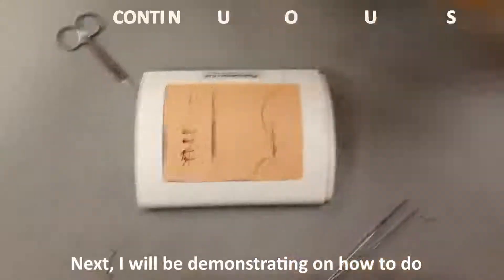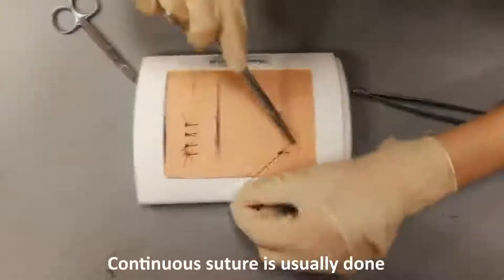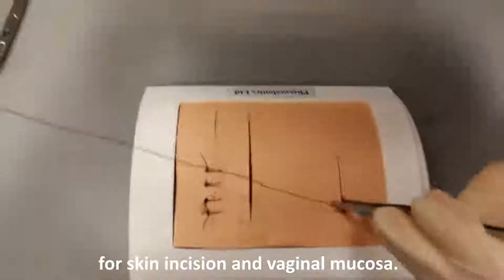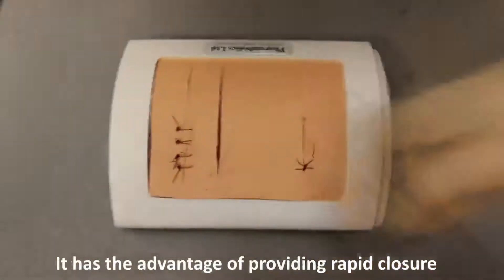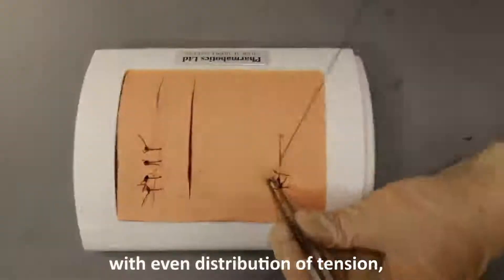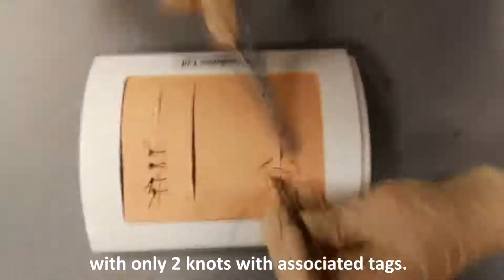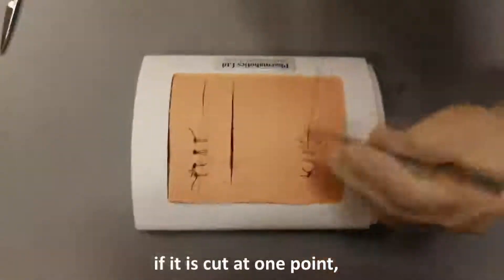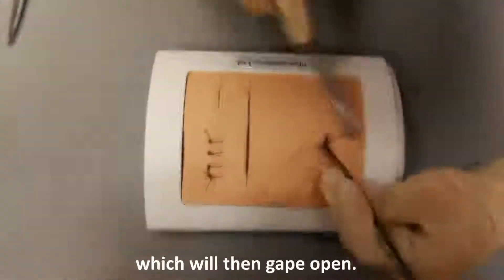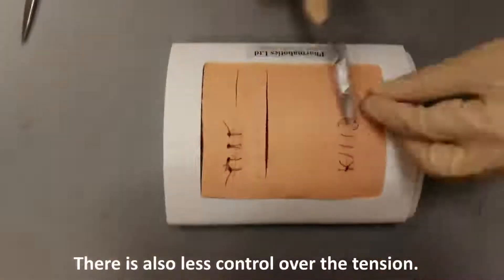Next, I will be demonstrating on how to do a continuous suture technique. Continuous suture is usually done for skin incision and vaginal mucosa. It has the advantage of providing rapid closure with even distribution of tension, more watertight closure, minimizing the need for multiple knots with only 2 knots. However, if it is cut at one point, the suture slackens along the whole length of wound which will then gape open. There is also less control over the tension.